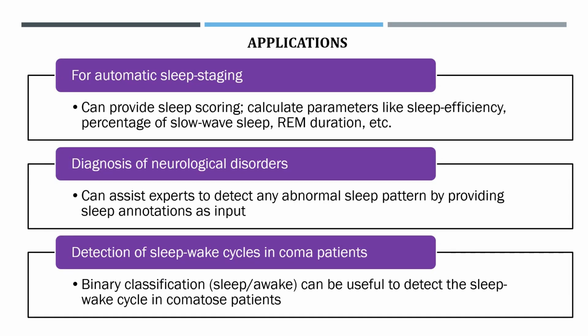And finally, the applications of this study: it can be used for automatic sleep staging. Also, it can be used for the diagnosis of neurological disorders. For example, Alzheimer's and Parkinson's are detected at a much later stage. However, if we analyze the sleep patterns, then they can be diagnosed at a much earlier stage. So MEFFR can provide sleep annotations as input and assist the experts to detect any anomaly.